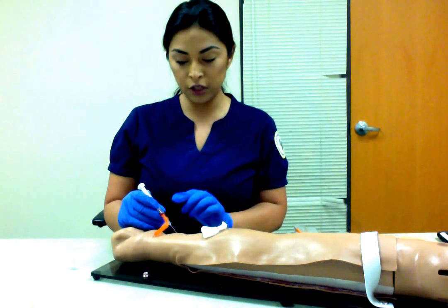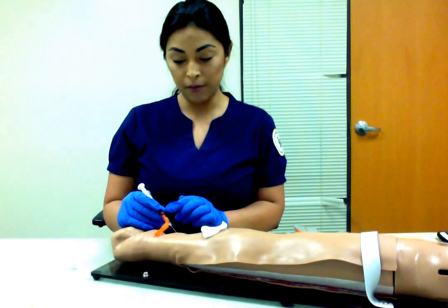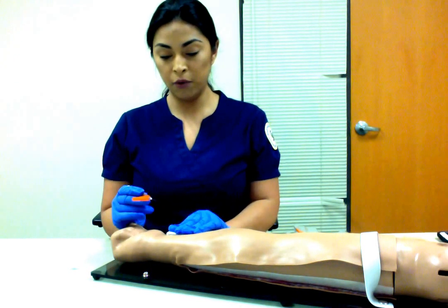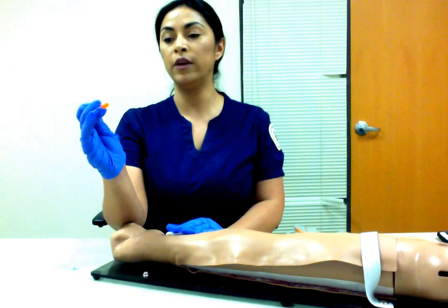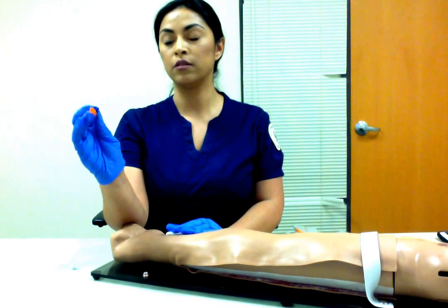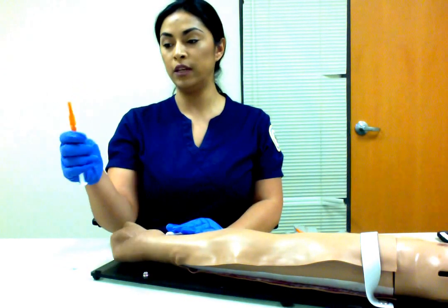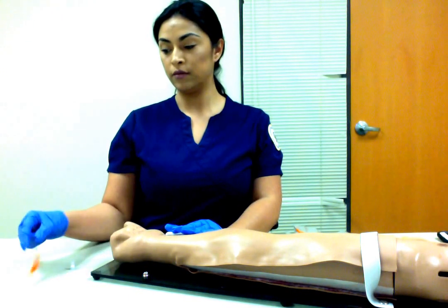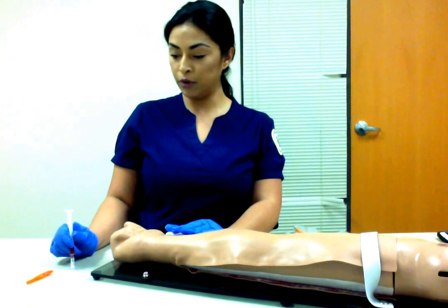If you have hit an arterial artery, then you should see a flash of bright red blood. Then you apply pressure to the site. You would cap the needle away from you. At this point, you can remove the needle. And go ahead and cap your sample.